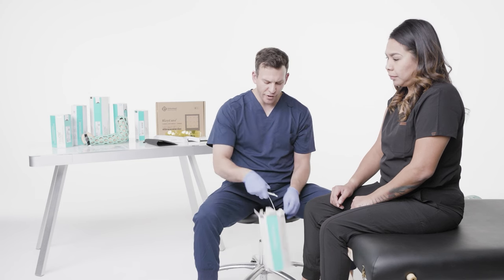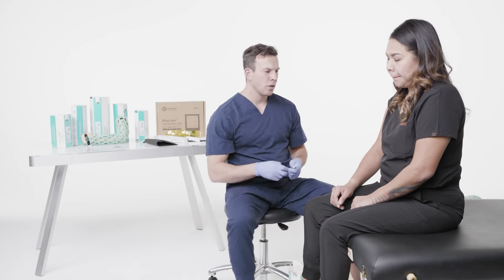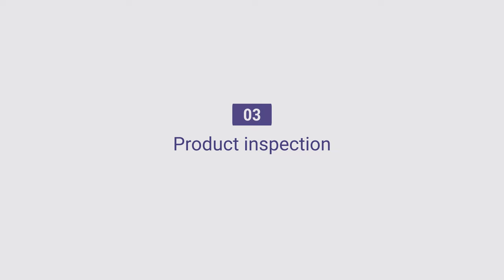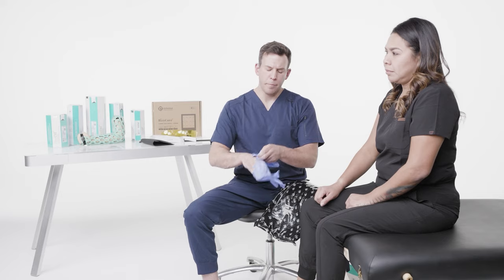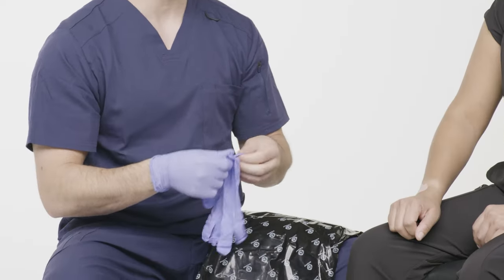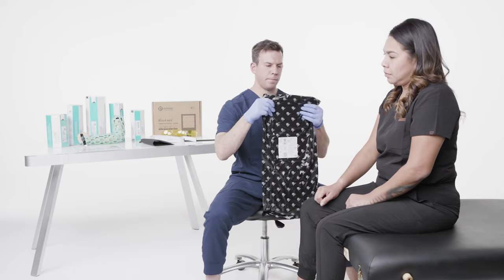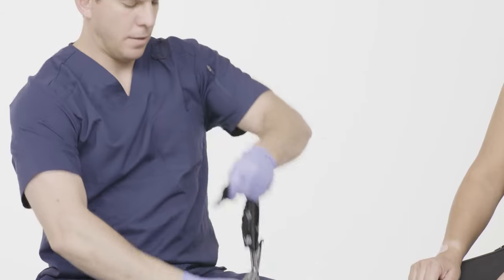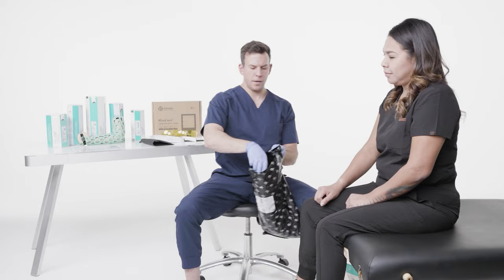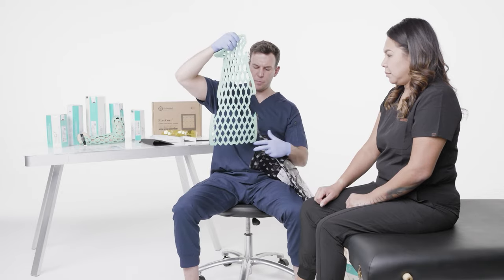What's going to come with every long arm is zip ties and a velcro strap. After we're done applying the long arm immobilizer, I'll show you what we do with the zip ties and the velcro strap. Before I open this bag, I'm going to put my gloves on just to protect my skin in case there's any resin leakage out of the silicone. I'll take a pair of scissors, cut open the bag, and pull the brace out.